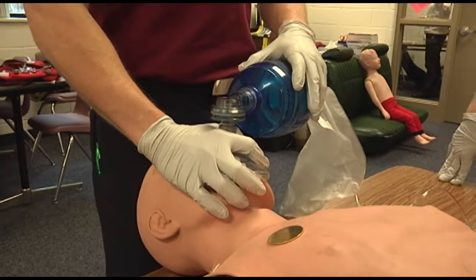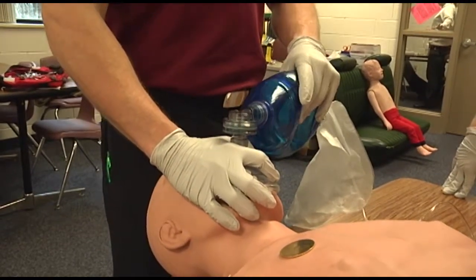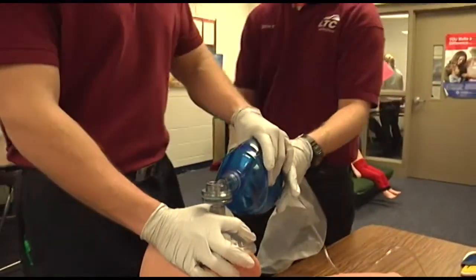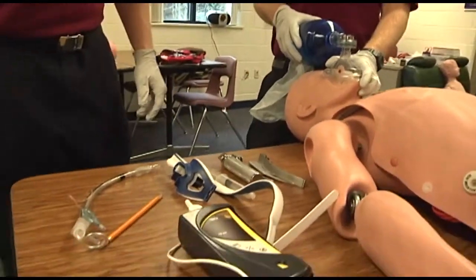Breath sounds are present and equal bilaterally, and medical direction has ordered intubation of the patient. The partner will now take over ventilation, and the assistant will pre-oxygenate the patient at this time.